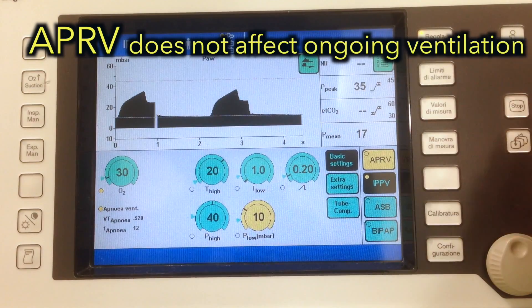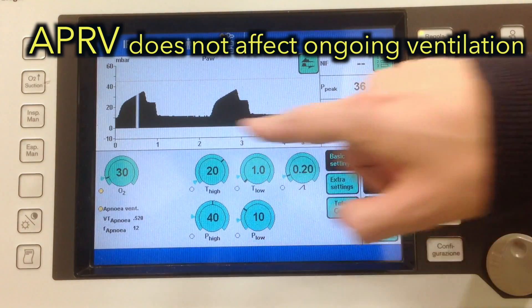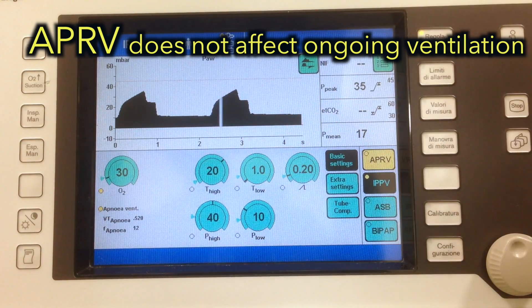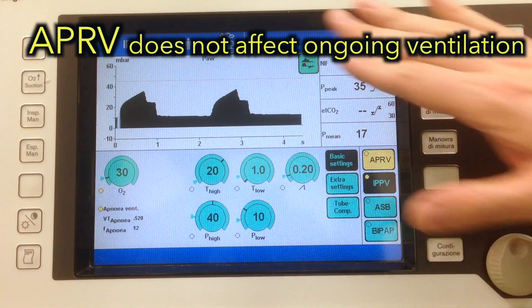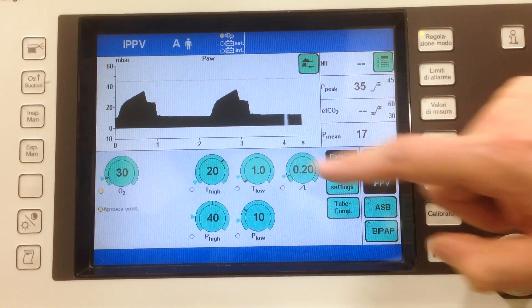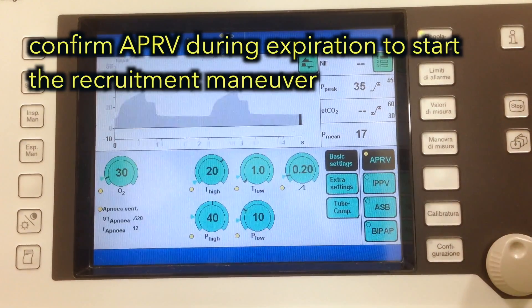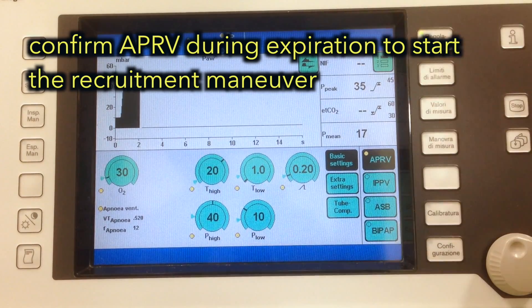Now, the advantage of this ventilatory mode is that even if we change the settings here, this will not affect the ongoing ventilation. Once everything is ready, during expiration, just confirm the APRV mode and this will start your recruitment maneuver.